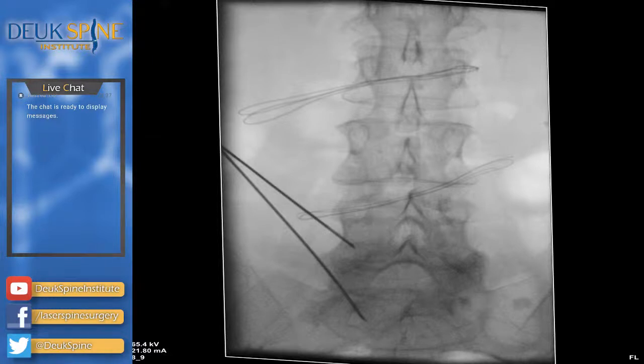And those lines, if you're wondering what they are, they're just the Raytec. You guys see those lines on the x-ray? That's this thing right here. It's a thread in the Raytec. And so you never leave a sponge in a patient. You can always see them.